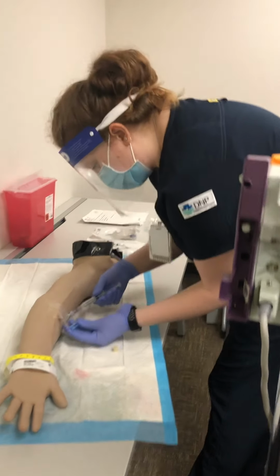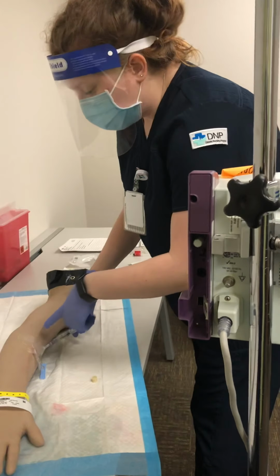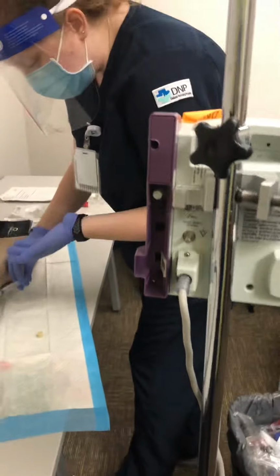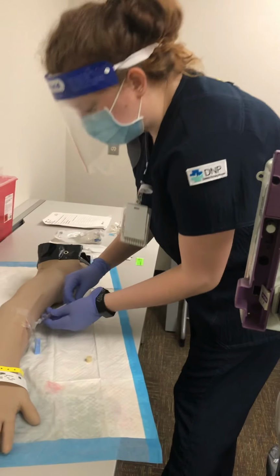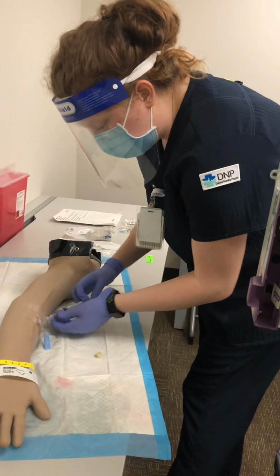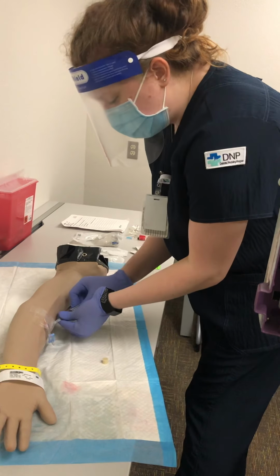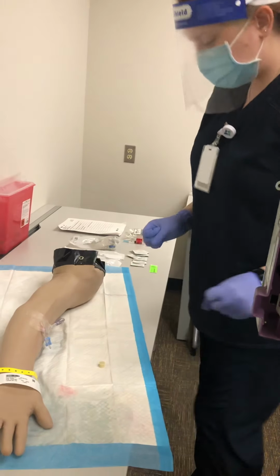There we go. I'm doing the lock. And I'm watching for any swelling, infiltration. Shirley, tell me if you have any pain when I do this. Okay, she says no. And before that, I would have aspirated for blood and then done my flush. So we're putting another lock on, taking off our empty syringe.